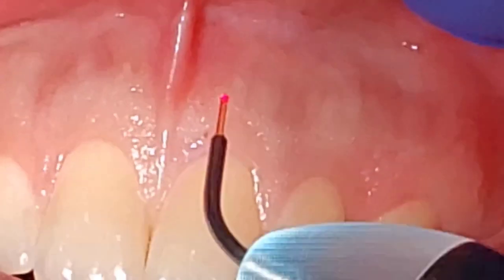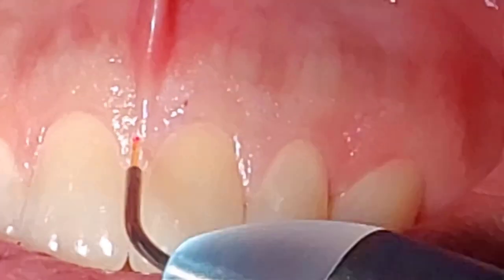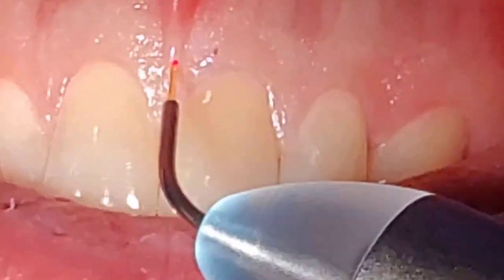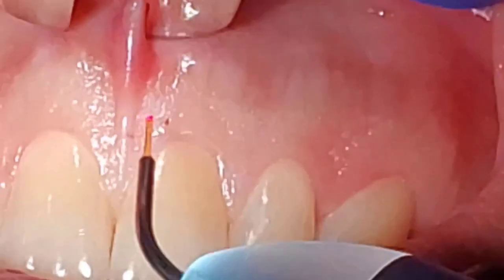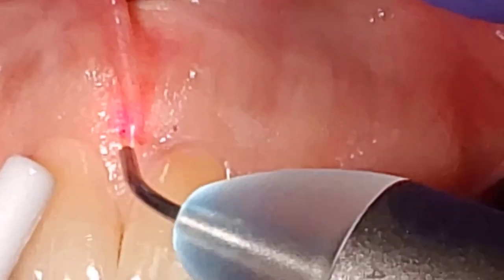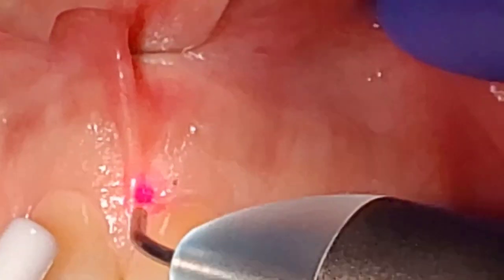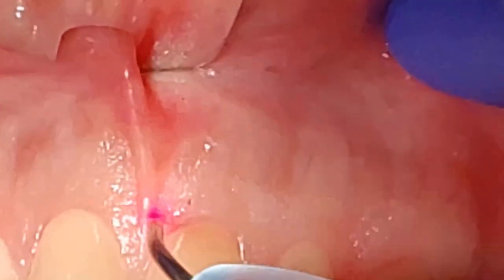So you see the frenum kind of runs all the way from the lip down to the teeth, and it's really important that we remove all this, kind of chop the roots of the tree, so we don't have relapse. The first thing we're going to do is just take the Gemini and hover over the soft tissue. And that's just going to heat it up. You feel anything at all? Mm-mm. Great. Patient doesn't feel anything. We've given a little bit of septocaine here, here, and here.